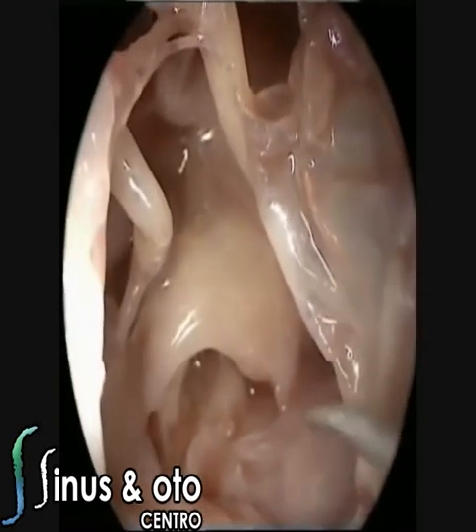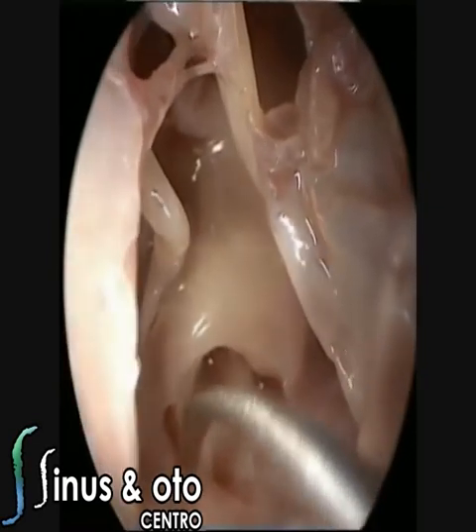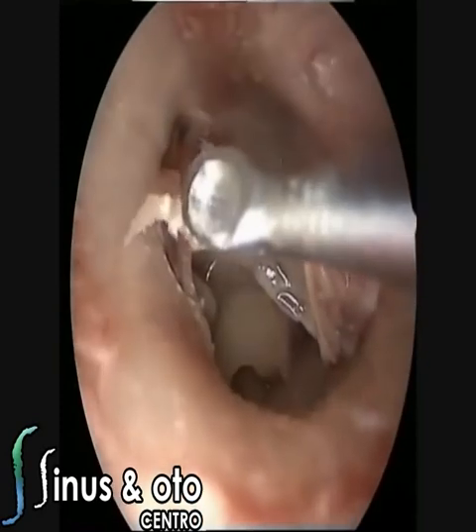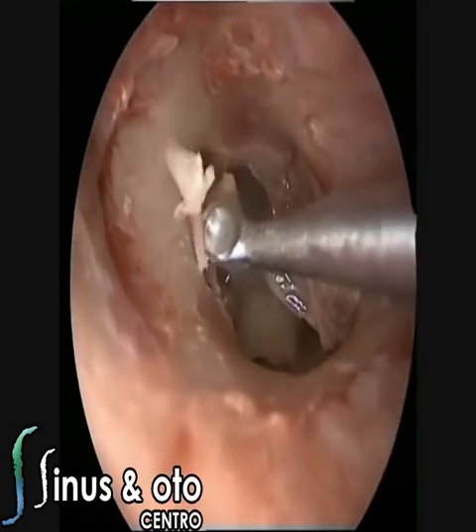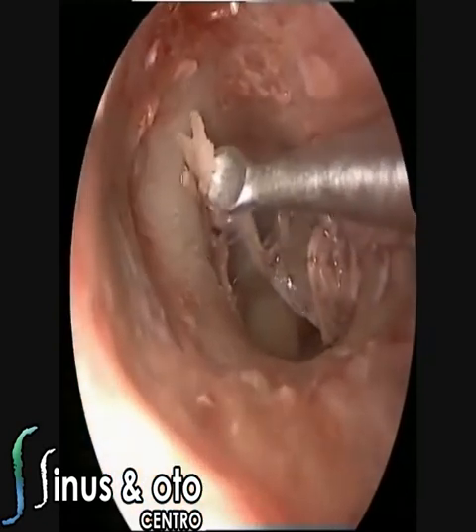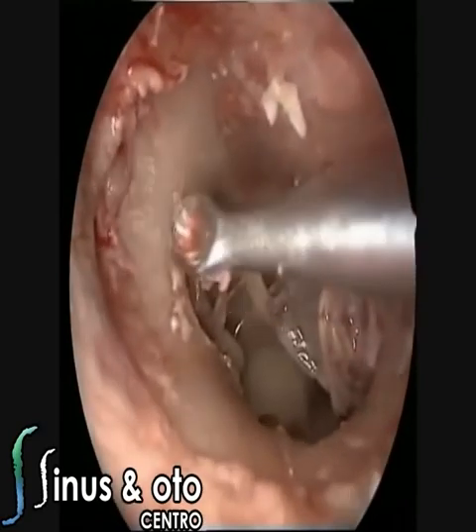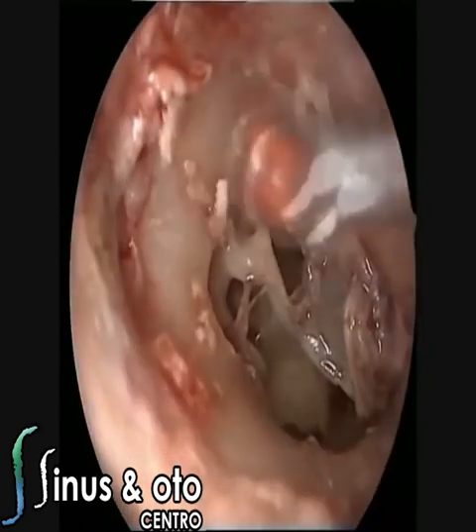With this 0-degree endoscope, just elevating the tympanomeatal flap, we can see the sinus tympani. The sinus tympani is a very important structure, since most of the recurrences of cholesteatoma are at the sinus tympani or the facial recess. With endoscopes, the endoscopic anatomy of the sinus tympani is a little bit different, and as you can see, we can identify some structures just like the ponticulus, the subiculum, the funiculus, the subcochlear tunnel when it's present, that can go directly to the petrous apex, and of course you can remove disease from the space.